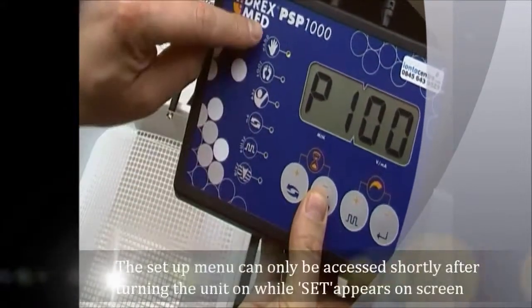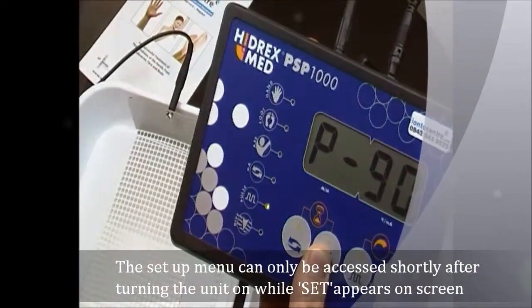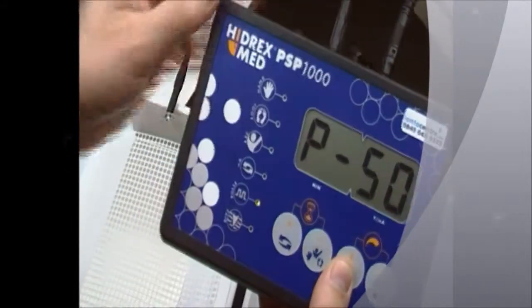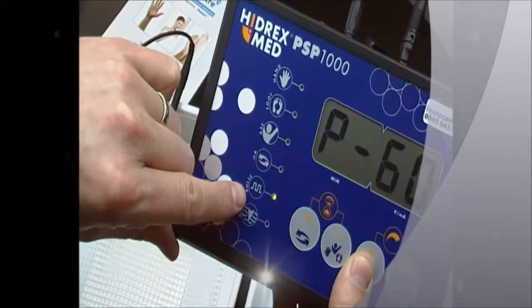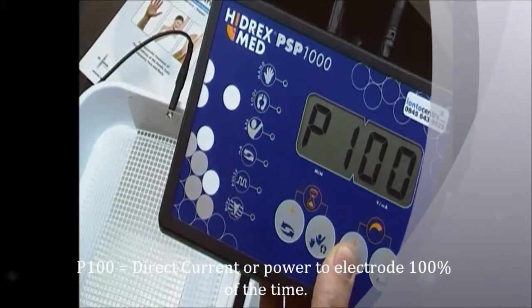As you can see, I'm going through the presets: hand, foot, underarm, and off — they're all off. Here's the pulse icon with the pulse light. I can turn it to P100, which is direct current, or standard pulse current. As I scroll through, the pulse light turns on and off to tell you whether you're in pulse mode. If it's illuminated, you're in pulse current mode; if it's off, you're in direct current mode.